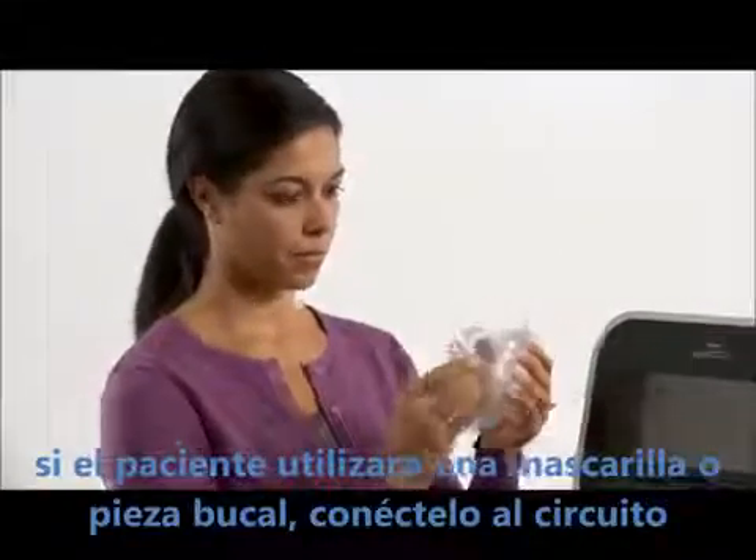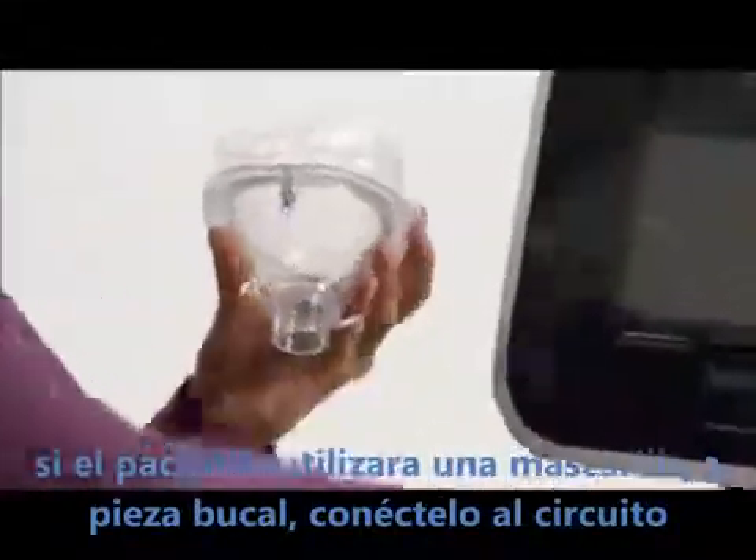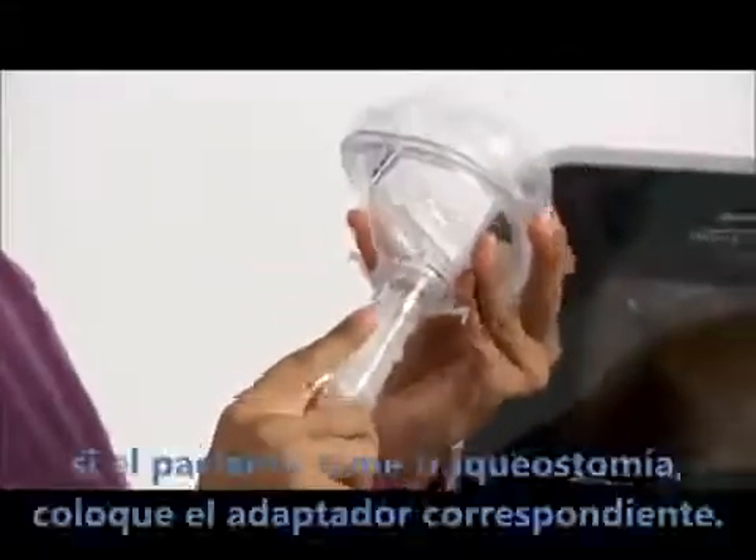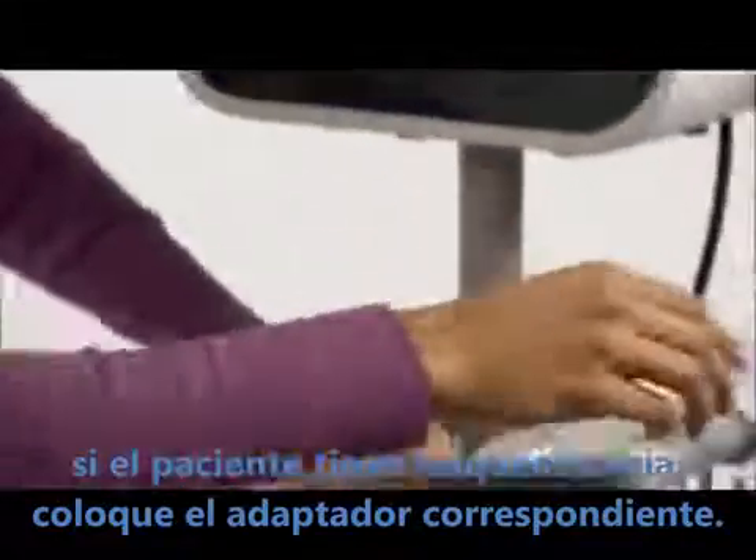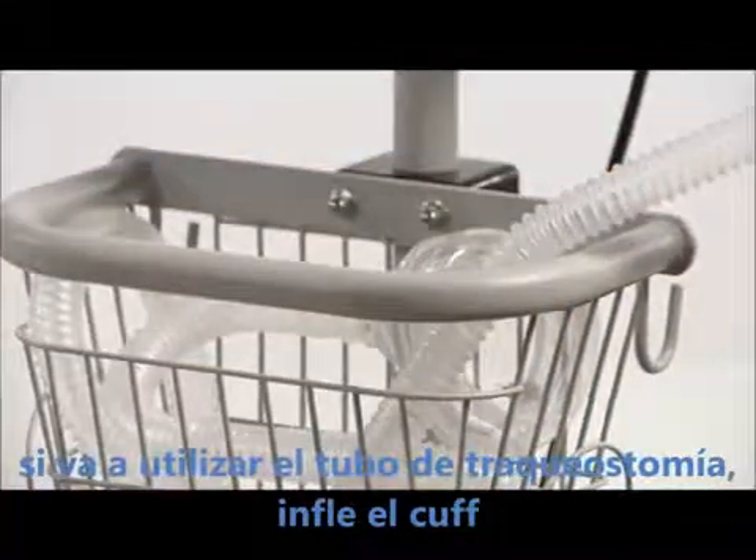If the patient will be using a face mask or mouthpiece, attach it to the circuit tubing. If the patient has a tracheostomy tube, place a trach adapter on the circuit tubing. If the trach has a cuffed tube, inflate the cuff.